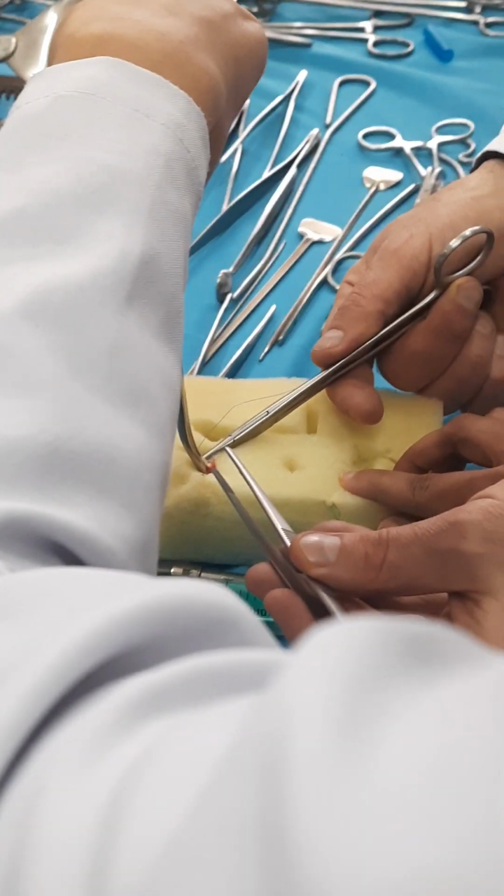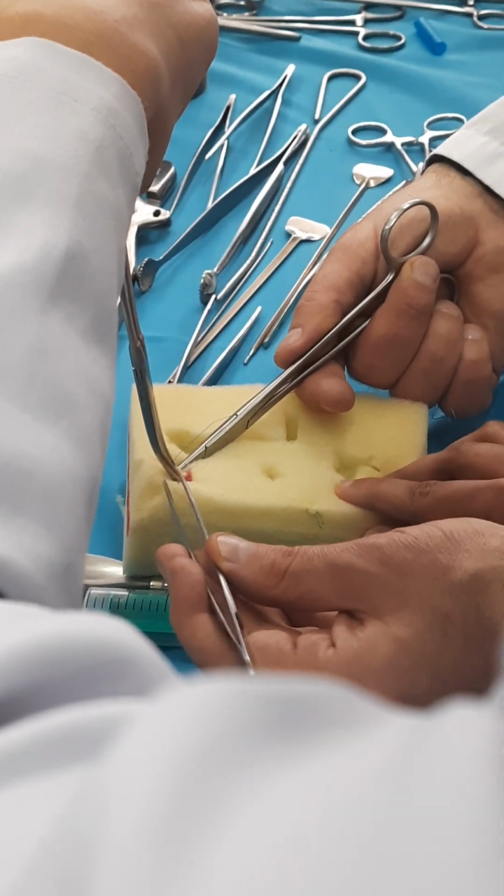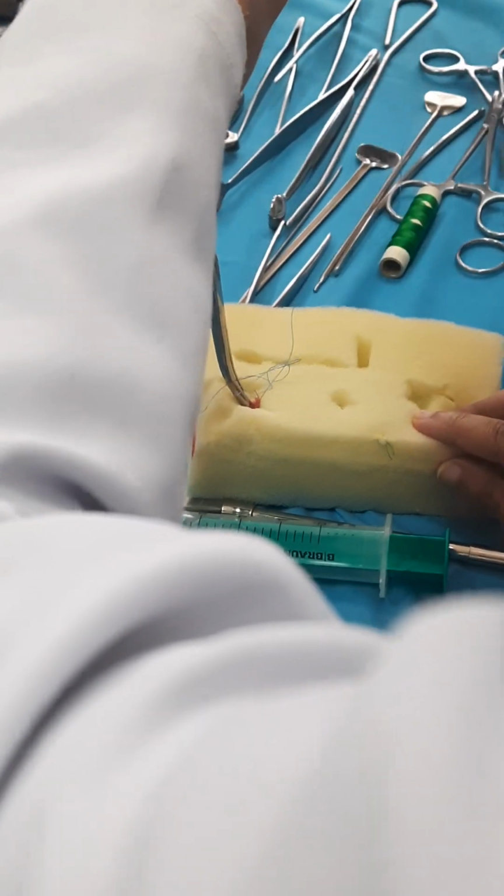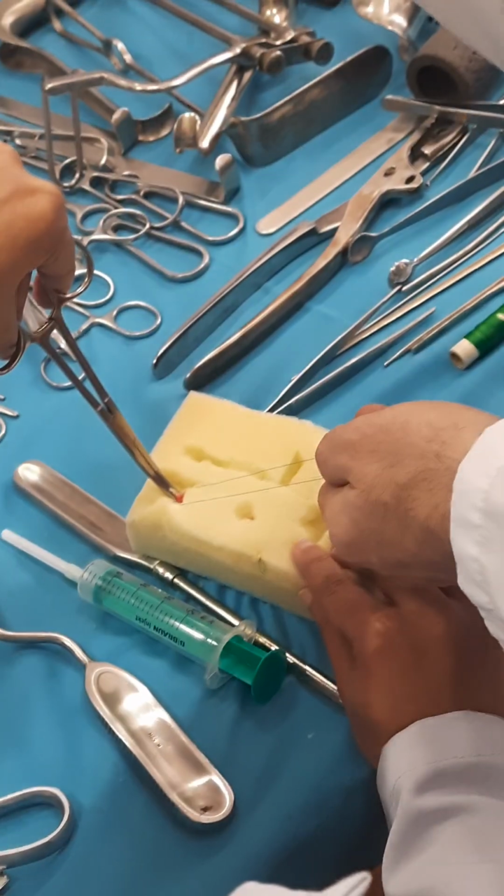Look, I provided my needle behind the instrument, I fix it. Now I open my needle holder, I remove my needle. And now again, I do the same, by the way, I do absolutely the same. I ligate it now, but then I provided the needle from the neighboring structure. It is fixed, the ligature in its place.